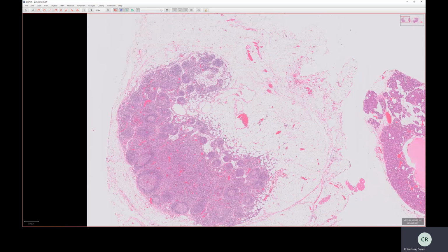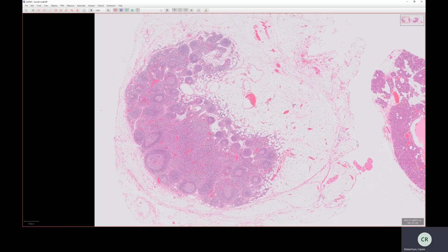with some blood vessels. The architecture of a lymph node is that you will sometimes see your lymphatics coming in to introduce a lymph, which has been drained from the tissue, into the lymph node. And then you might also see the efferent lymphatic leading away from the hilum. I don't think we can really see that here.